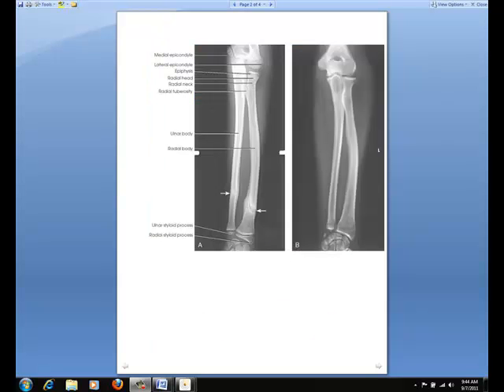When evaluating the AP forearm, the following should be clearly shown: the wrist and distal humerus, slight superimposition of the radial head, neck, and tuberosity over the proximal ulna, and you want to be sure that there is no elongation or foreshortening of the humeral epicondyles.